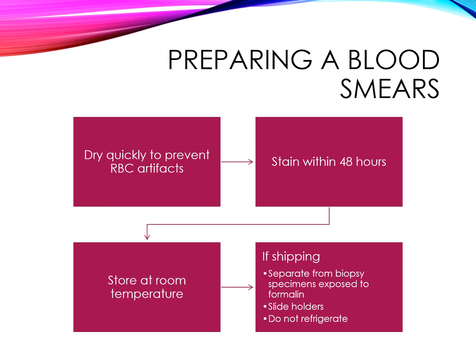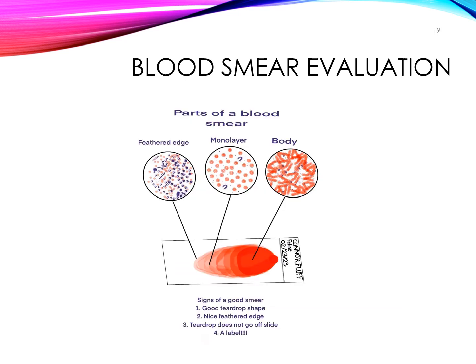And any unstained smears that may be sent out to a reference laboratory should be stored at room temperature, not in a refrigerator or freezer, because the water condensation will damage the cells. And also any unstained smears should be stored away from formalin fumes, and also shipped separately from any biopsy jars that have formalin in them, because formalin vapors can inhibit the optimal staining. So just some things to keep in mind with your smears and slides. Okay, so on a good smear, again, you can see that the entire shape is on the slide.